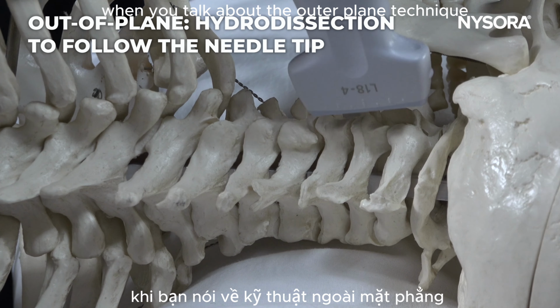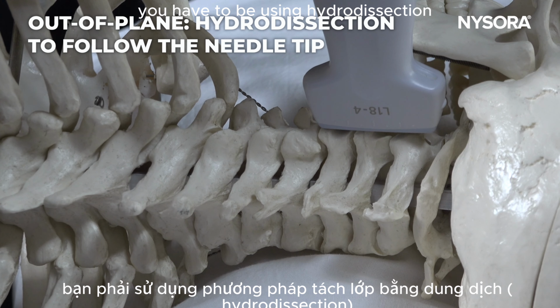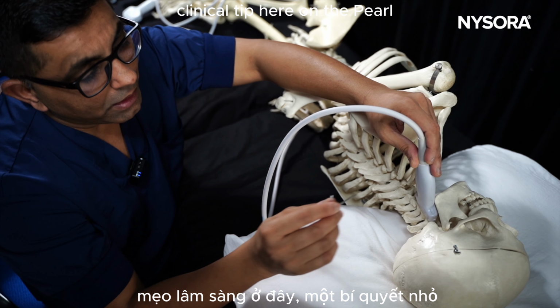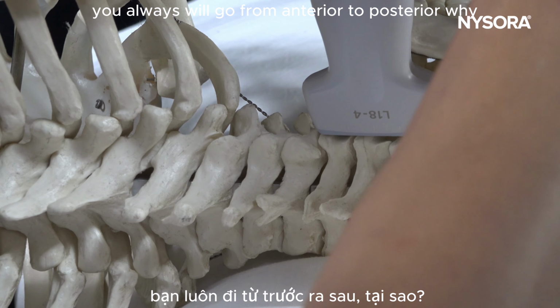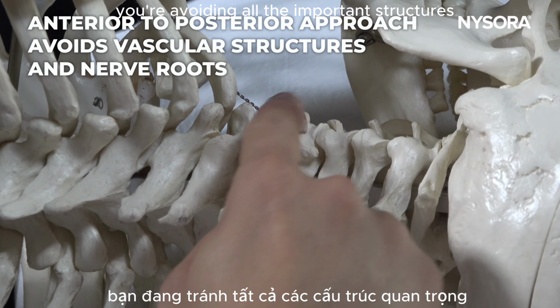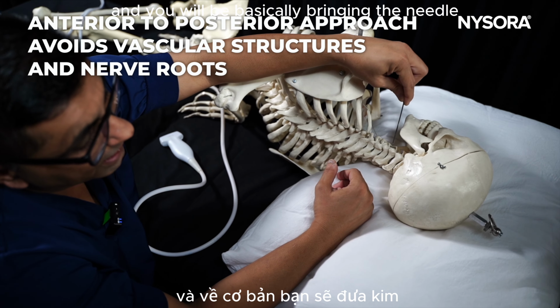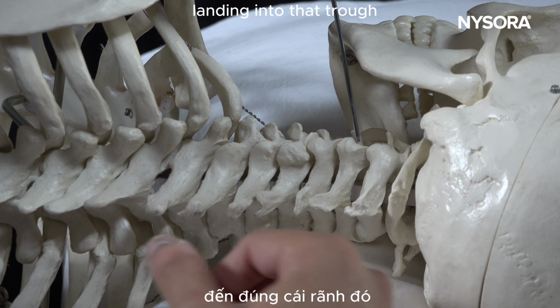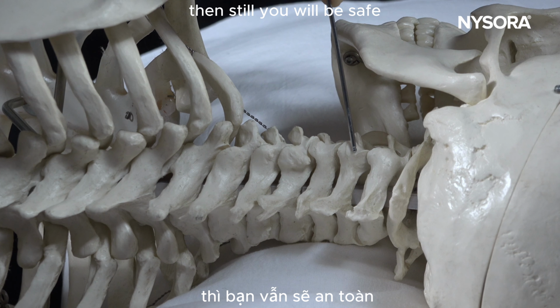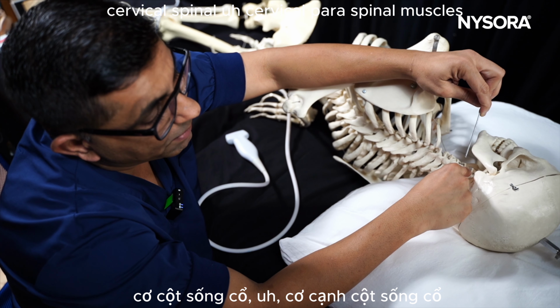When you use the out-of-plane technique with the longitudinal approach, you have to use hydrodissection to make sure you chase your needle tip. A clinical pearl here is that you always go from anterior to posterior. Why? Because when you go from anterior to posterior, you avoid all the important structures, including the carotid artery, vertebral artery, and nerve root. You bring the needle from anterior to posterior, landing in that trough. If you miss the bony target, you are still safe because you will end up in the posterior cervical paraspinal muscles.